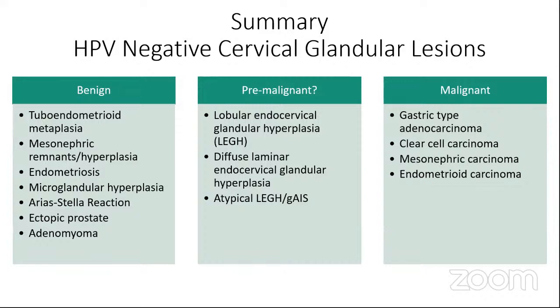There is another question about the gastric type adenocarcinomas. What are the regular immunostain panels that you use to differentiate from a metastasis? Yeah, so if you have a site that's involved by something that looks like gastric type and you don't have any clinical history, there's really very few stains that you can do. PAX8 is one that, if it's positive, it's helpful because about two-thirds of cervical gastric types will be positive, at least focally. But if the PAX8 is negative, it doesn't really help you.